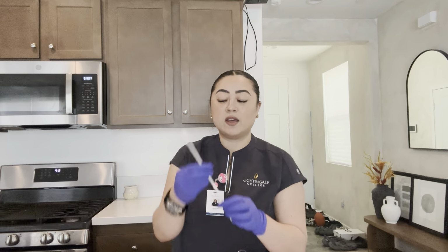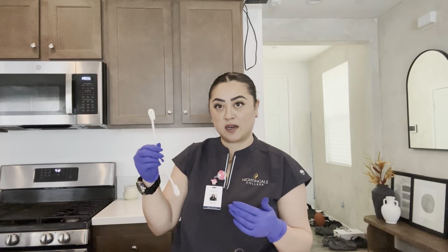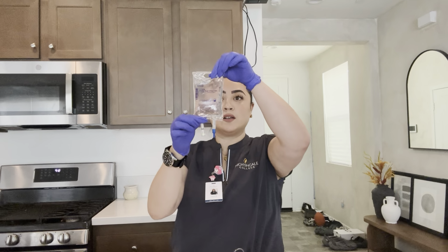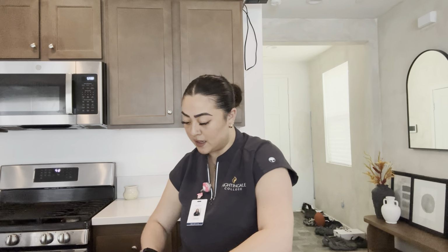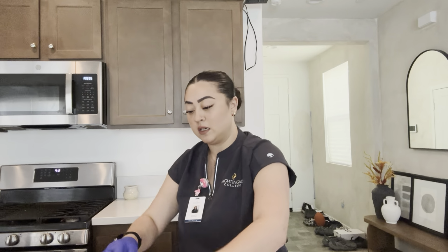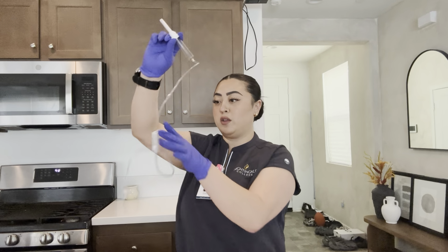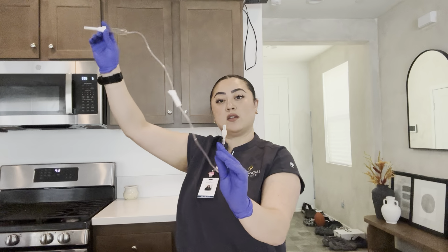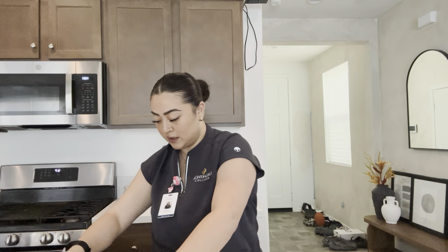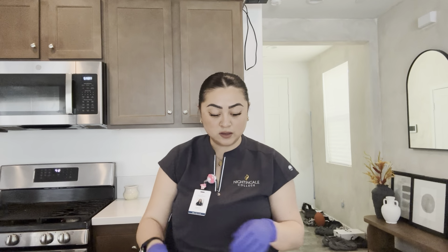All right. I also have this tool right here. It's just to help hang the piggyback or the medication bag. I have that here as well. Here's the little bag. And right here you can see that this is the secondary set. The tubing that goes along with it has the spike, the chamber, the clamp, and then right here the little port. And then I have some alcohol swabs here as well to clean.